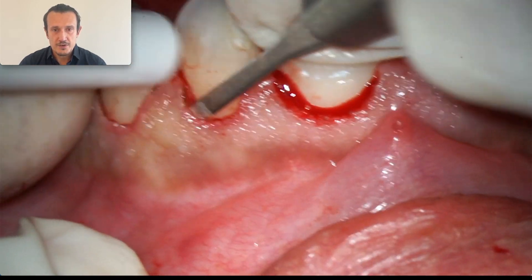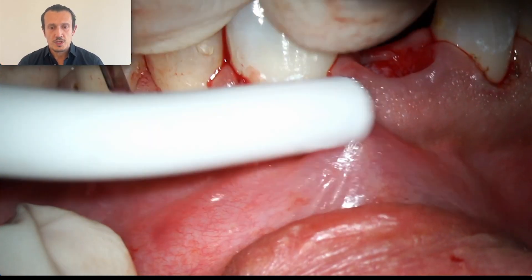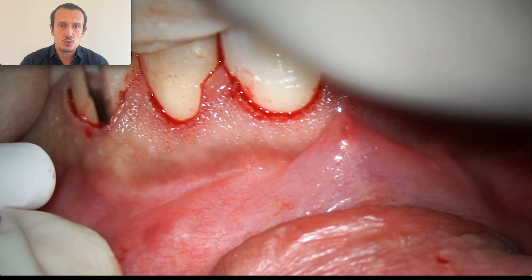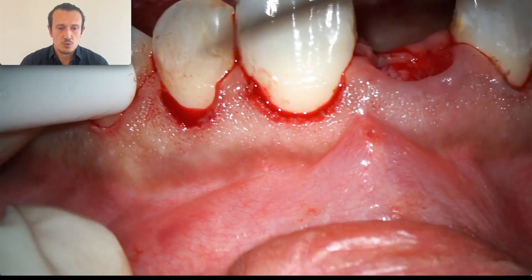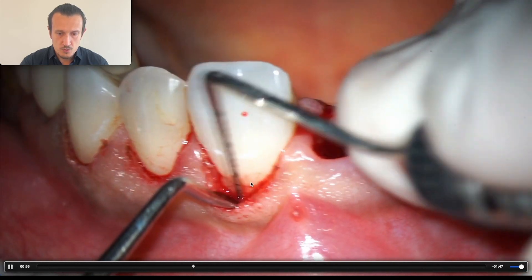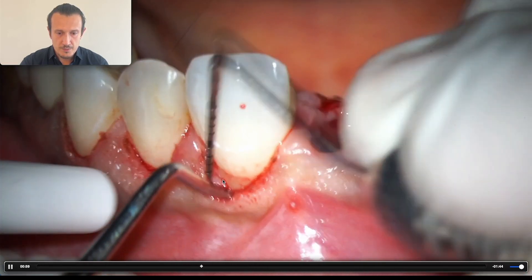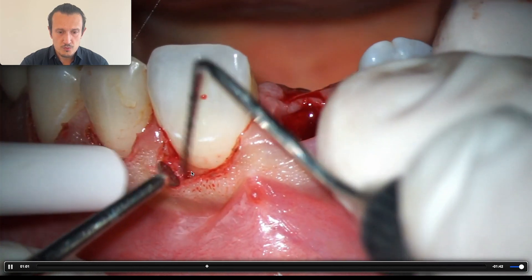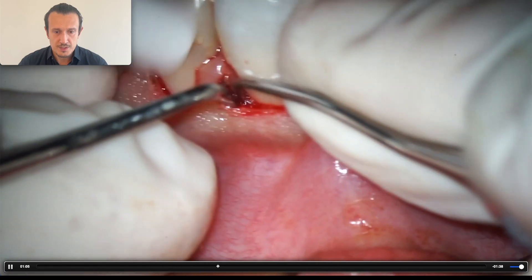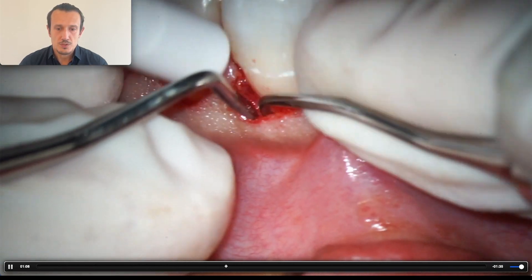Through the microscope you can see very nicely where the CEJ of the natural tooth is and where the bone is, and which part of the bone I need to remove in order to recreate the biological width. Here is the CEJ of the tooth, and from here we need three millimeters — so this bone I will have to remove. I'm going to use a curette or small rotating instruments for this.